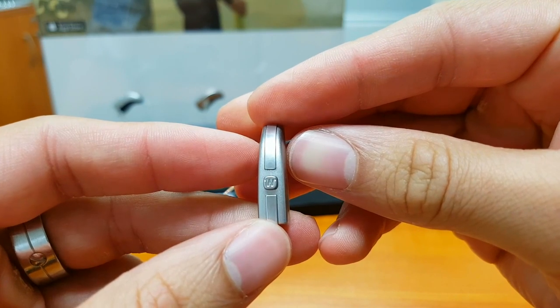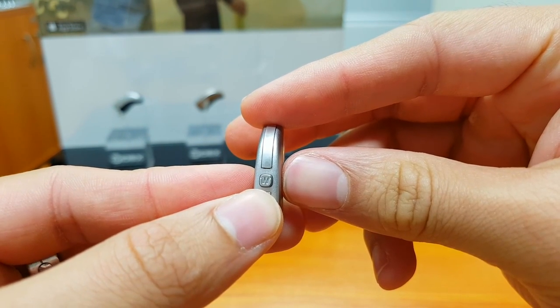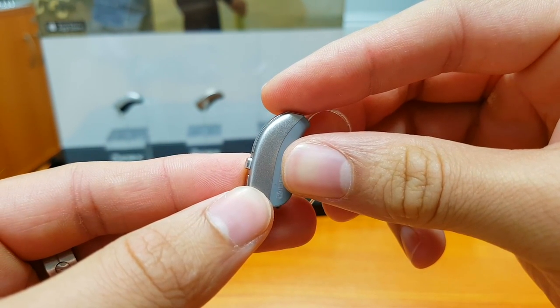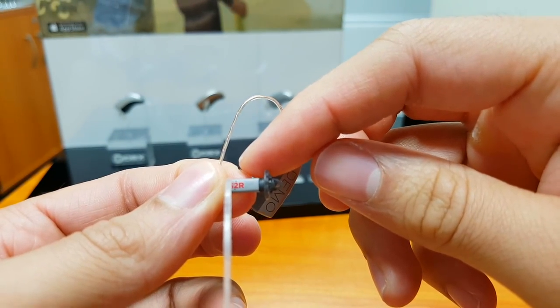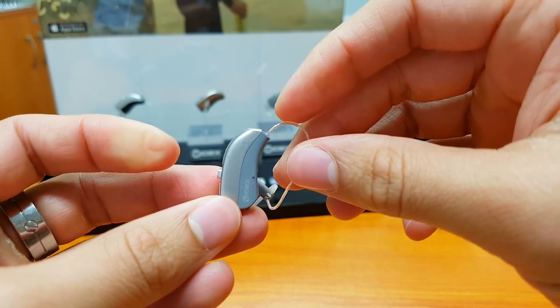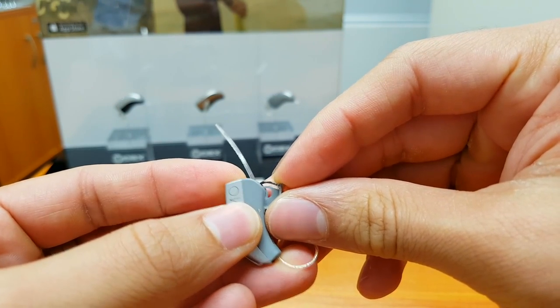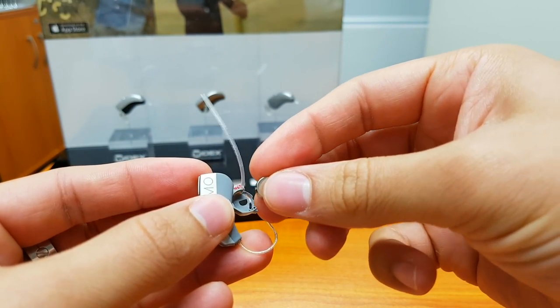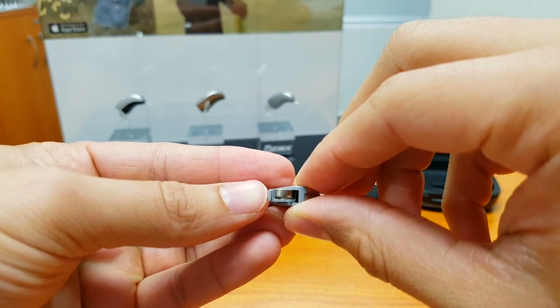Taking a closer look, we've got a button at the back. That button can act as a volume control, program control, or a bit of both — it depends on how it's programmed for you. Since it is a receiver-in-the-ear, we've got a thin wire connecting to the speaker unit and a rubber dome on the end with a plastic lock. The Fusion is a 312 device, so we pry open the battery door and place the 312 battery inside and close it.